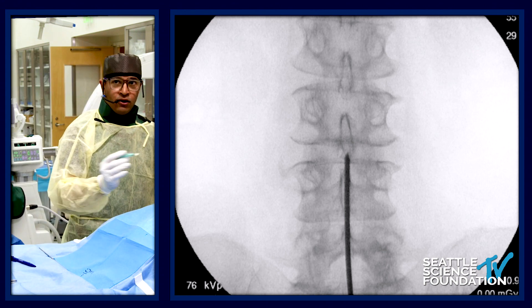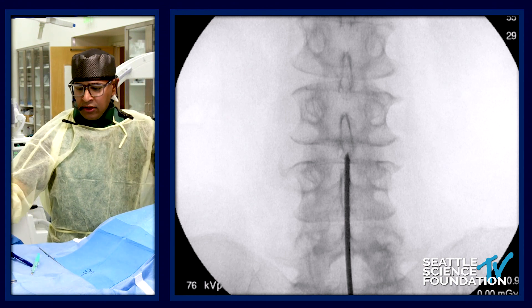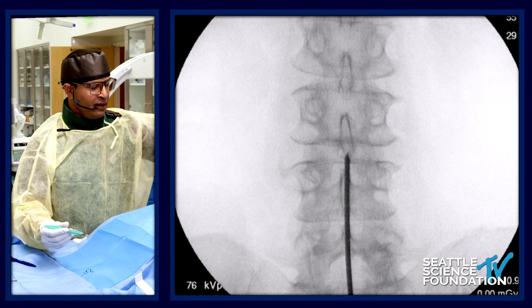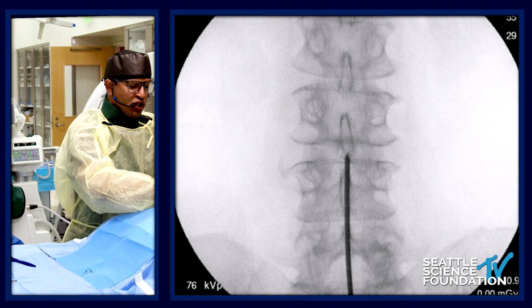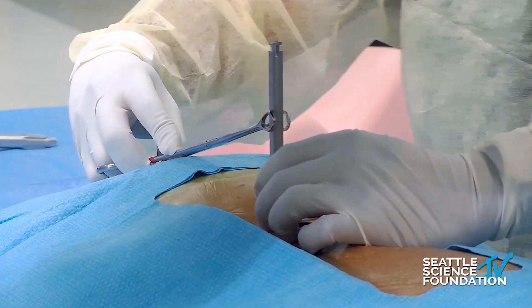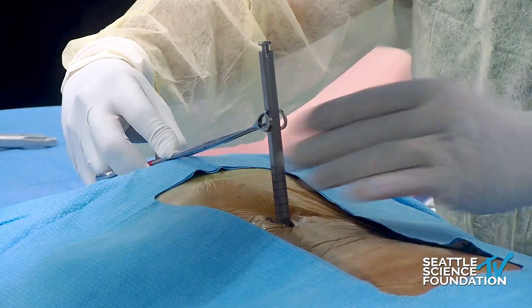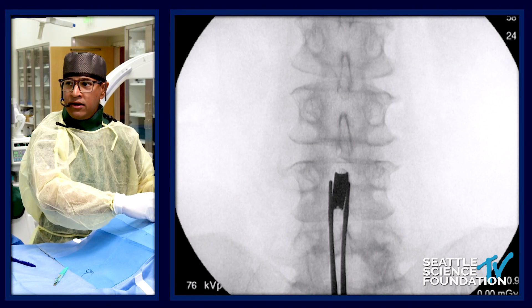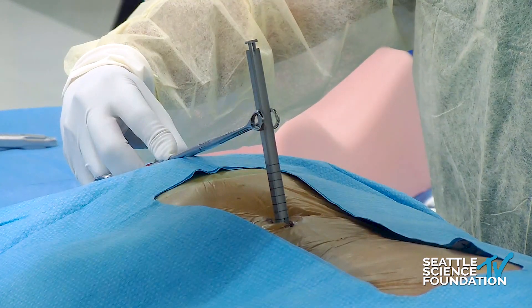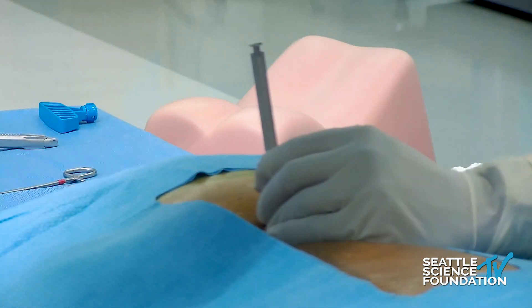Make a firm 1.5-centimeter incision straight down. Use electrocautery if needed. Get a sense by feeling into that interspinous groove — there's a tendency to use fluoroscopy alone, but use all your senses. One thing you may notice is I don't have the handle on. Most people use the plastic topper, but the fidelity of my maletting is better with just the metal pin.